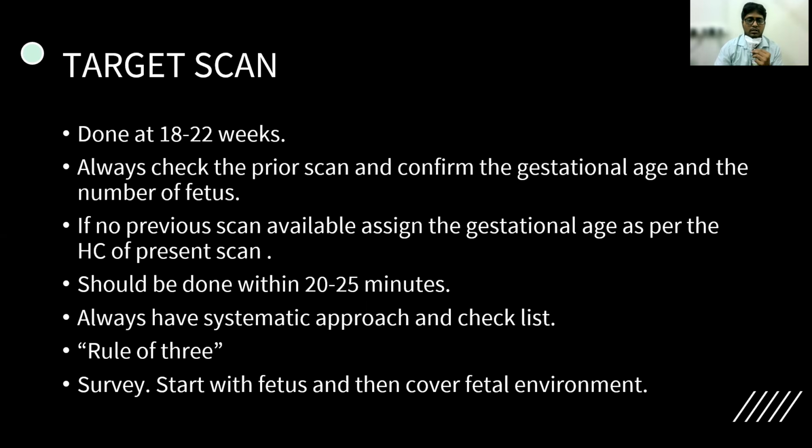And as discussed earlier, the ALARA principle, as low as reasonably possible, has to be followed for the reduction of fetal exposure to ultrasound. So the scan should be done within 20 to 25 minutes. If you're not able to do it, we can ask the patient to rest for some time and then do it again. If we are not able to get certain parts or certain angles or certain views on day 1, we can also ask the patient to come on day 2, because each and every view is very important to rule out particular anomalies and for documentation.